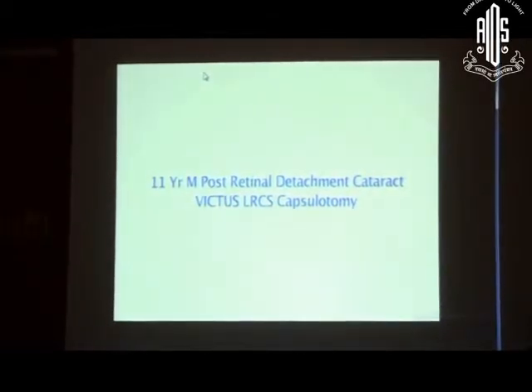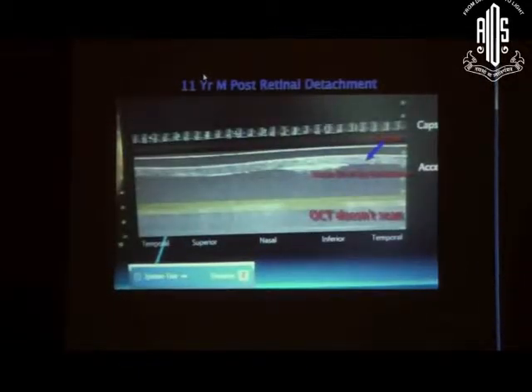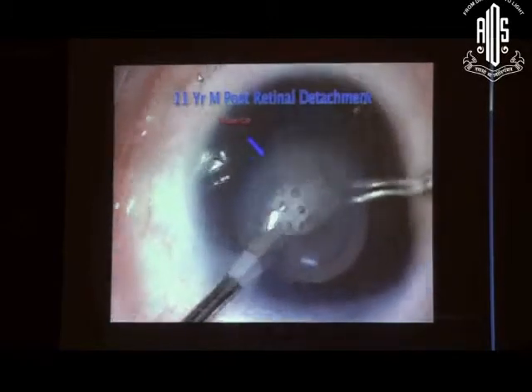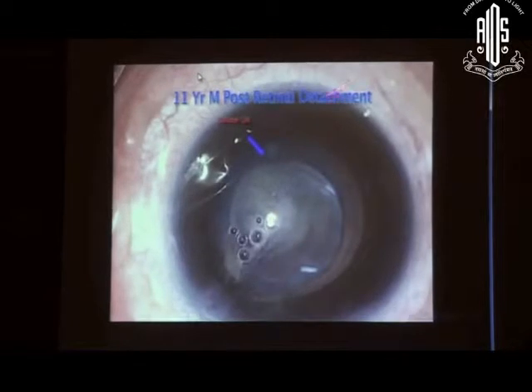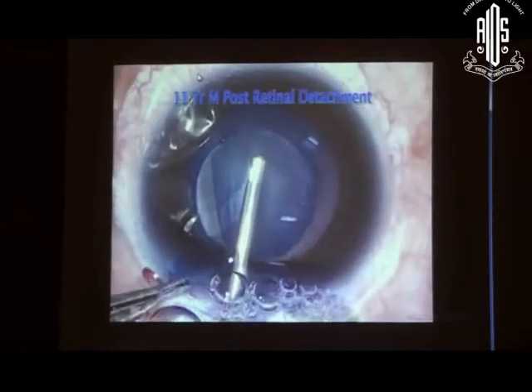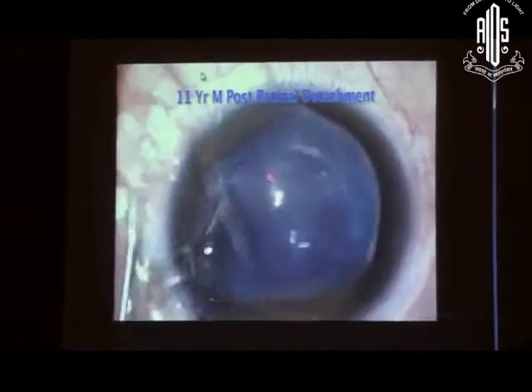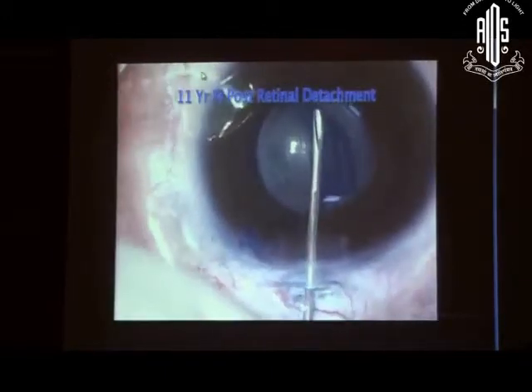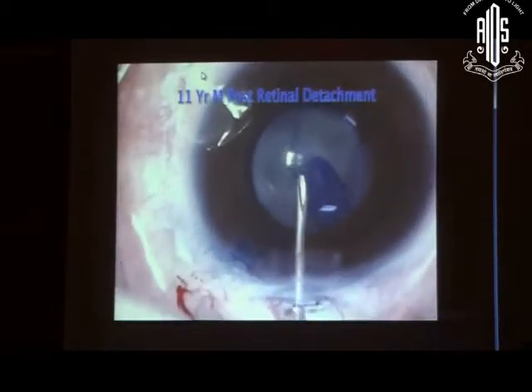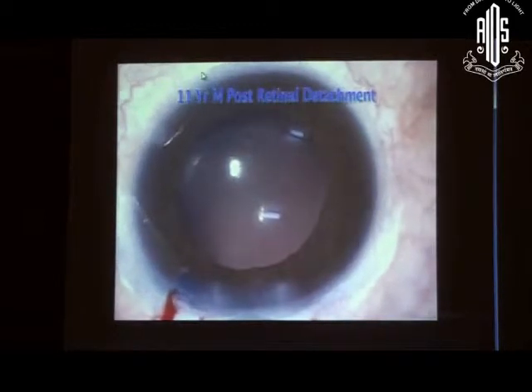Then what about a retinal detachment surgery already done in this 11-year-old, with silicone oil and a little bit of silicone oil in the anterior chamber? I was worried that the laser may not penetrate, but once again something to learn here is there is an incomplete cut in this area, but that can happily be completed manually, so not an issue. And at the end of the day you are going to get an absolutely nicely centered and very circular capsulotomy. So I found it very beneficial in those kinds of situations as well.